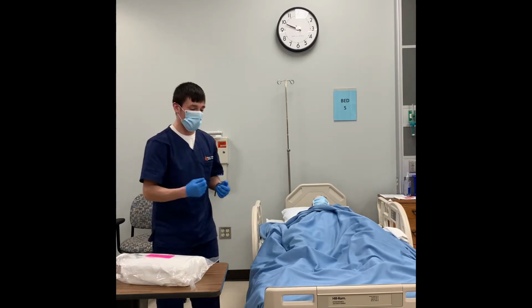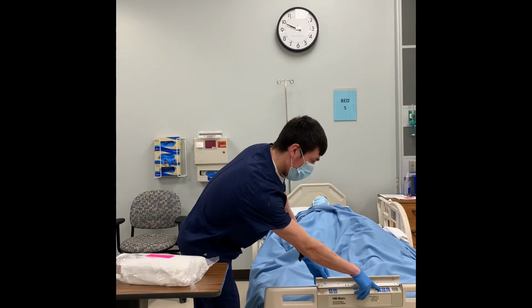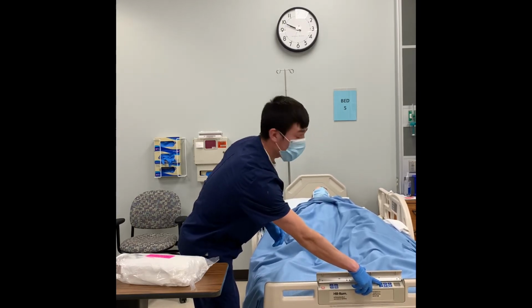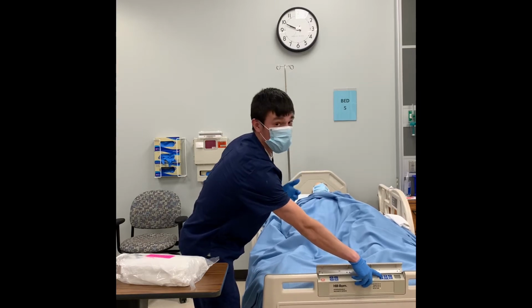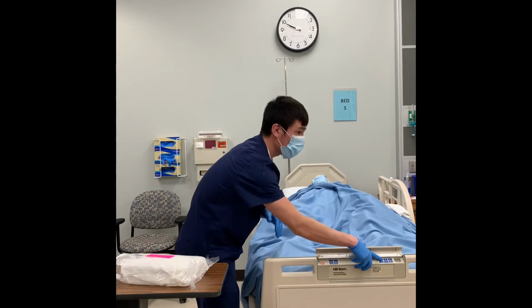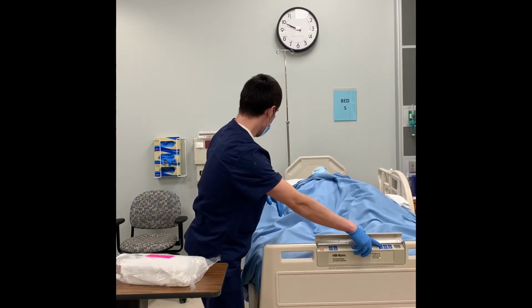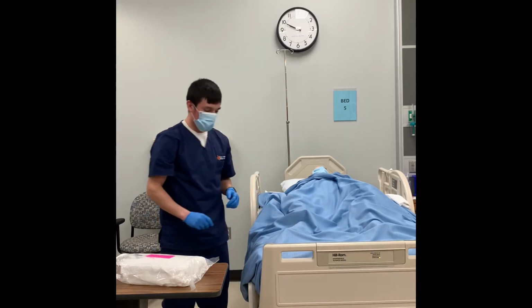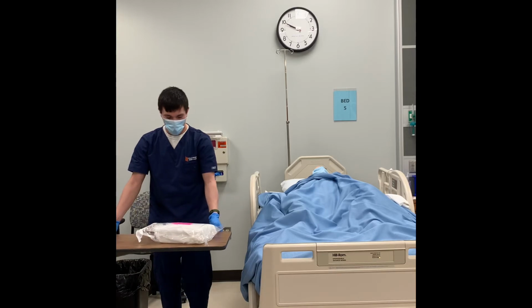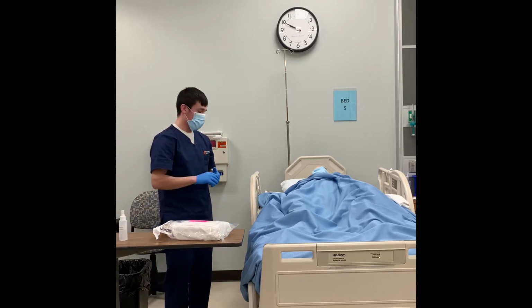So I'm going to go ahead and lift the bed. As I lift the bed, I want to make sure, again, that we're doing proper body mechanics, so I want to have an appropriate height for me. I don't want to be hunching over as I do this. All right. And then from there, I'm going to bring in my catheter kit and the tray as well.